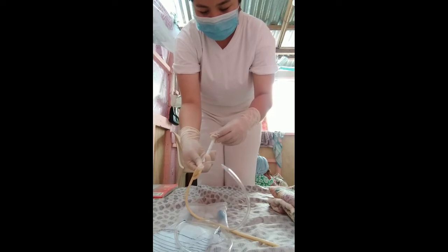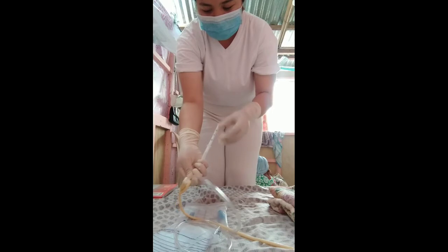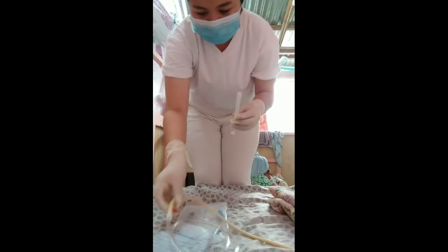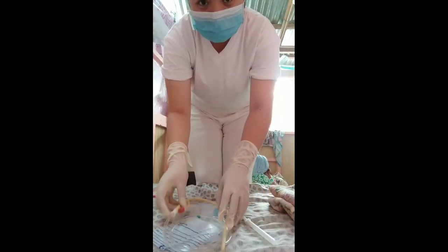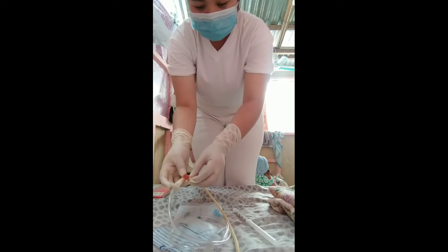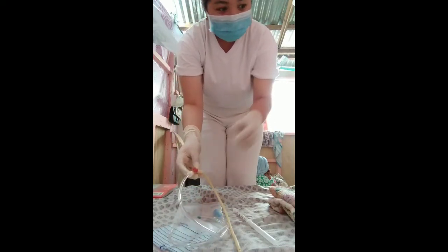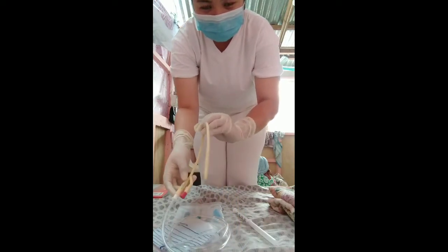Remember, do not pull back the syringe. So we are done inserting the 10 cc water into the catheter port. So we are ready to clean the meatus and insert the catheter into the urethra of the patient.